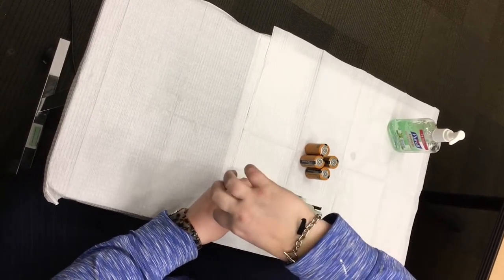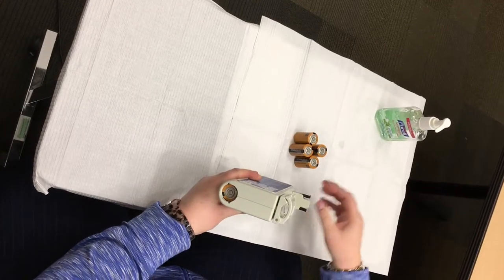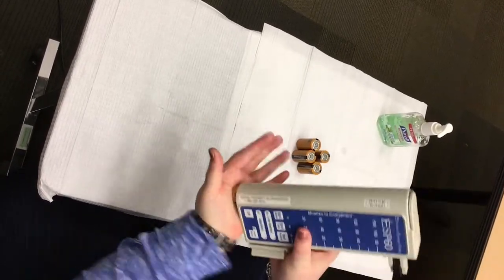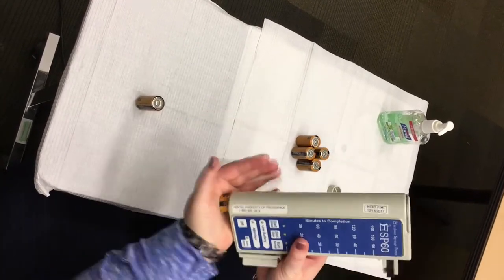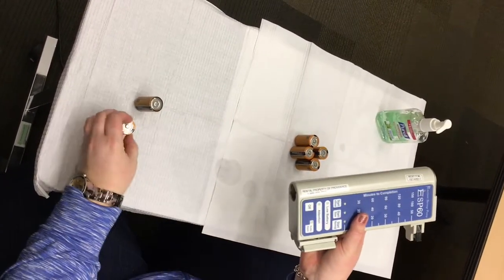Remove the cap and the old batteries. You may have to briskly swing the pump downward with an abrupt stop at the end, using the weight of the batteries to generate enough momentum for the batteries to drop out of the pump.